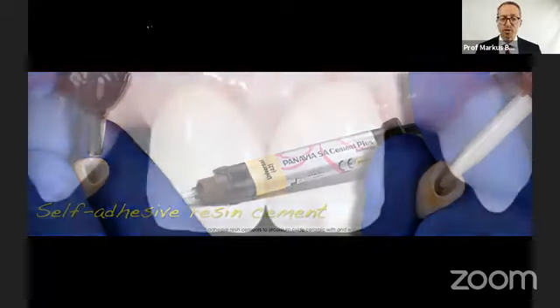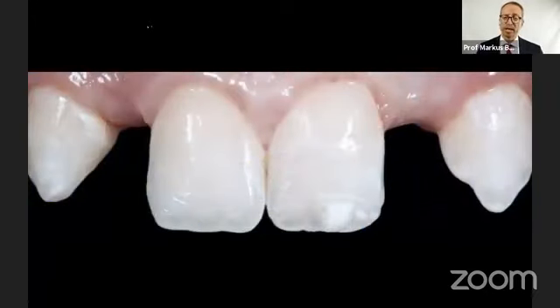It's different, of course, when you have a situation like this and you want to use a bonded restoration. This patient was not old enough to have an implant placed. Some people may not have the money. So there is a very nice alternative, I find, and we do more and more. This patient was after orthodontic treatment and didn't have lateral incisors.